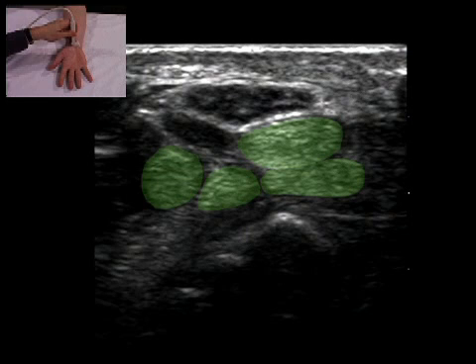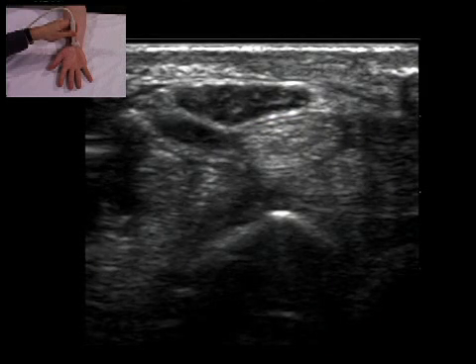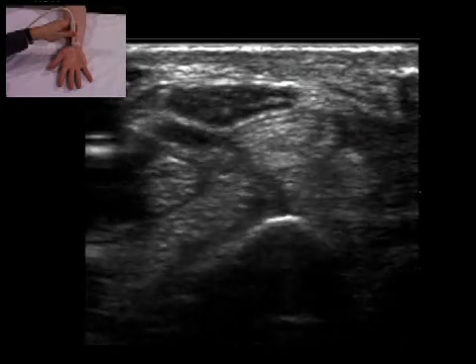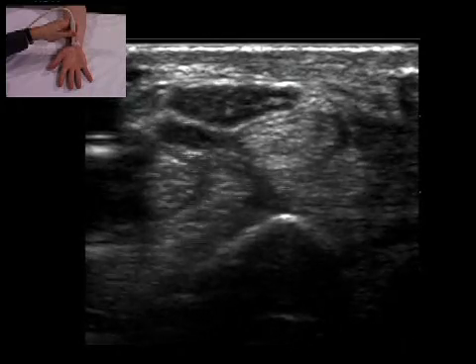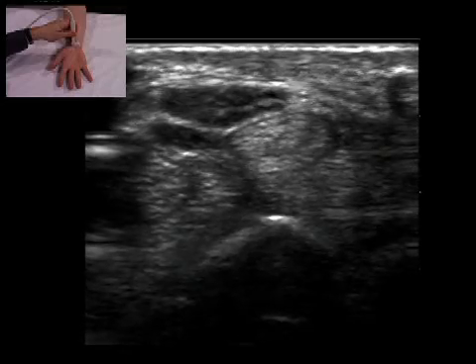Beneath the median nerve, the flexor digitorum tendons are speckled. Movement of the fingers identifies the flexor digitorum tendons.